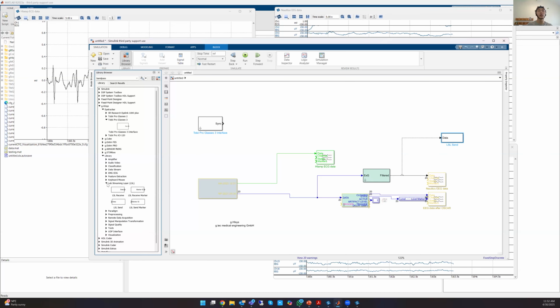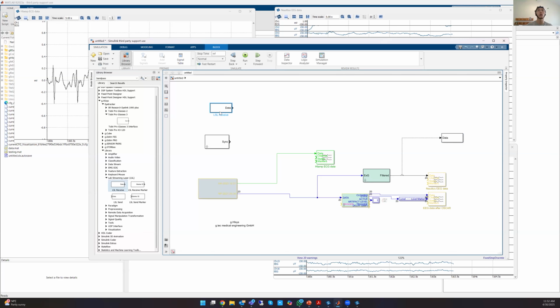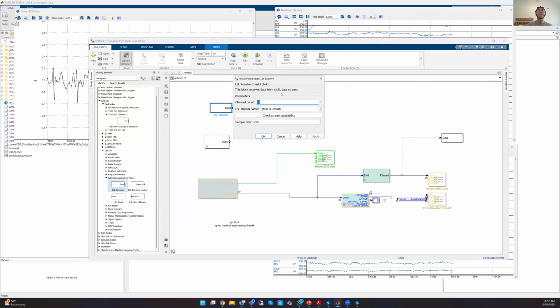Maybe one more thing to add is there are lots of devices in the market, not just EEG, eye tracker, etc. If you have third-party devices you want to integrate with our amplifier, a lot of the time the software supports an LSL send function. So if you're sending a control signal from that particular device to this model, you can do it through the LSL receiver end.